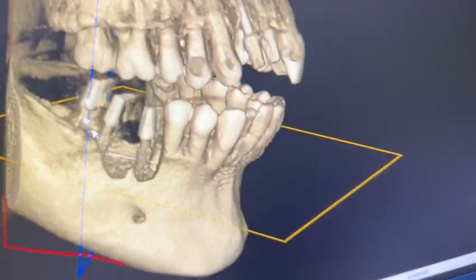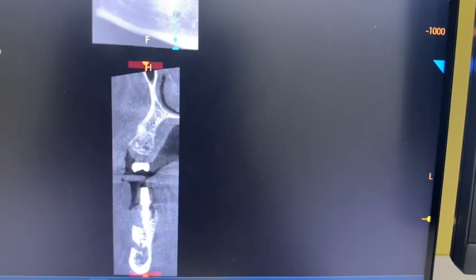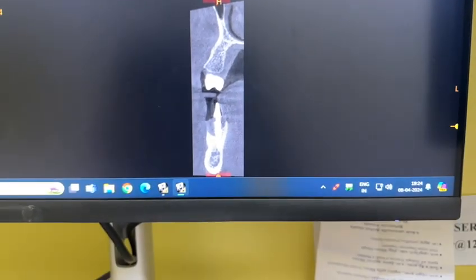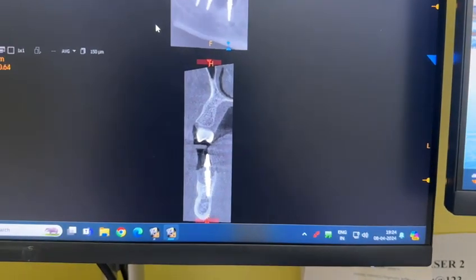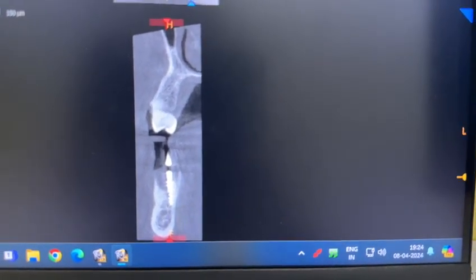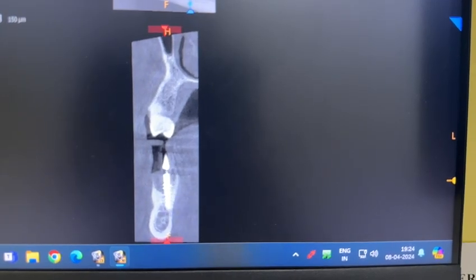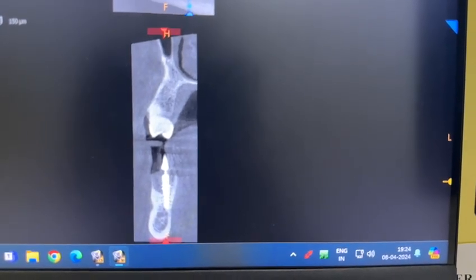So we have placed 3 implants, one BCCX and 2 compressive implants. We will see the BCCX implant. So since it is a smooth surface implant, exposure of the threads outside buccally is not an issue. We could have used a BCS design also, but this is not a place for compressive implant.